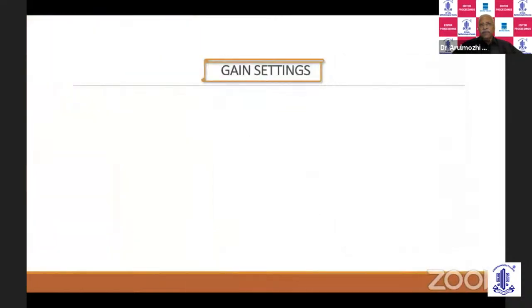We can have different settings. One would be whether you're doing the whole recording on the automated mode or the manual mode. Automated mode has its own gate settings. If the spikes go up to the gate setting, which is considered good enough by the auto mode, it would accept that and record it.